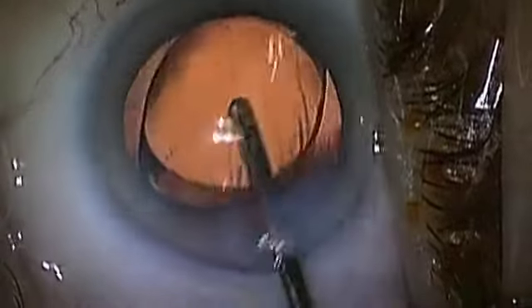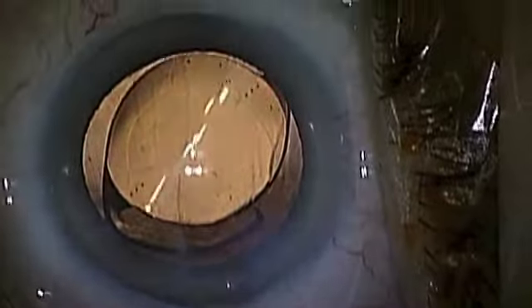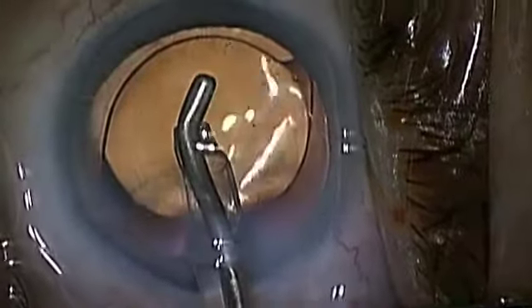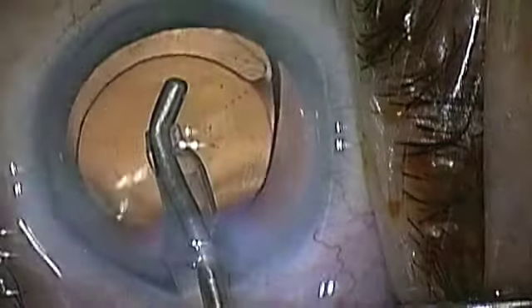The anterior capsular opening is critical in holding the intraocular lens in the correct position, making sure it doesn't move out of position, and also making sure that the postoperative results are what we want. You can see this can be done manually, and I've done thousands of cases this way. A new generation of technology guarantees accuracy in this portion of the procedure.